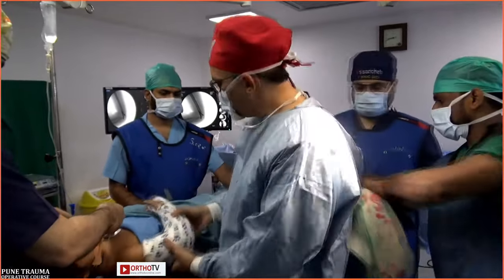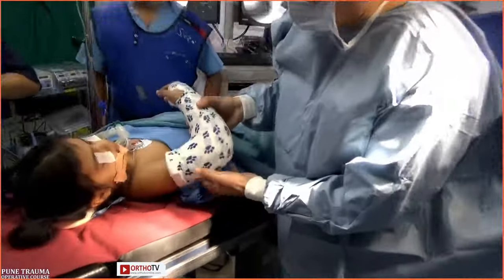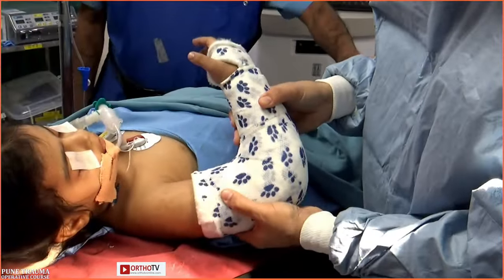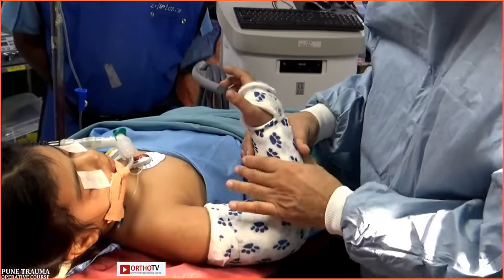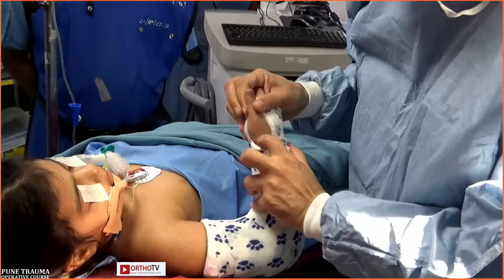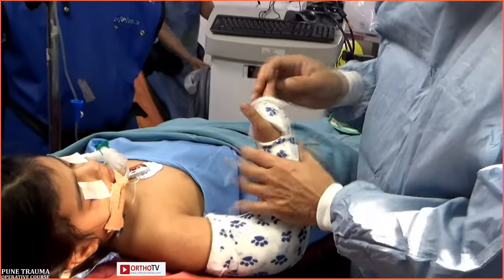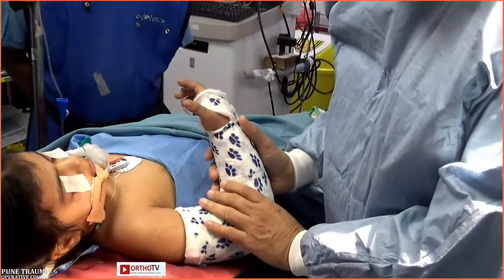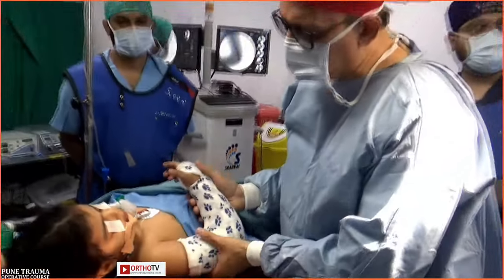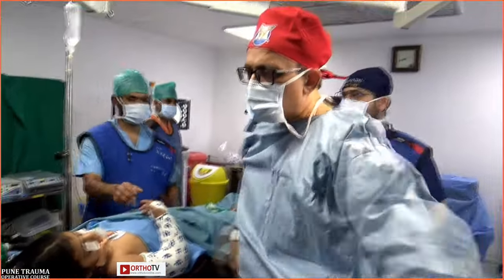Can you get the, yeah, you are here. See this. Rajiv, I think it was your voice. This is a soft cast which allows expansion. So this allows me expansion, and all these kids are admitted overnight for a day to watch how the stretch pain is, whether they require a lot of analgesics. Right, so you monitor the three A's: anxiety, agitation and increasing analgesic requirement. If that is the situation, I will split it.